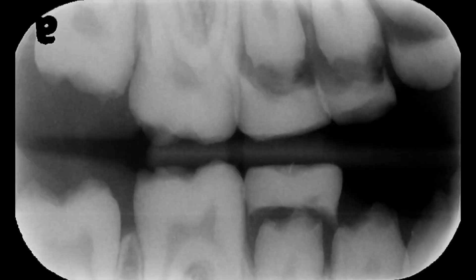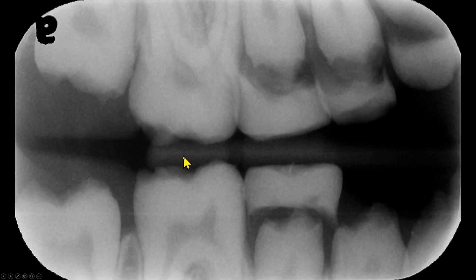On this bitwing radiograph, we see that the patient is in mixed dentition. On all the teeth, we do not see any evidence of enamel. There is no density difference between the dentine and what should have been an enamel layer.